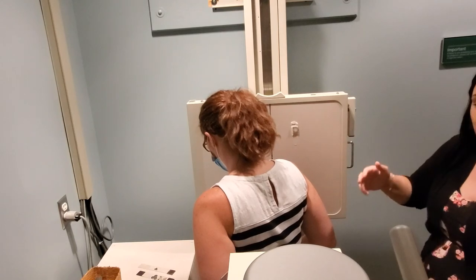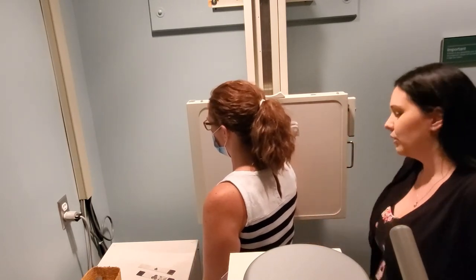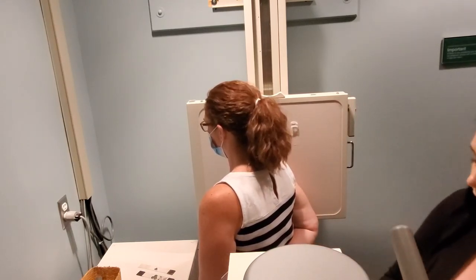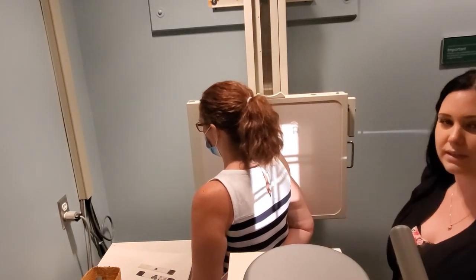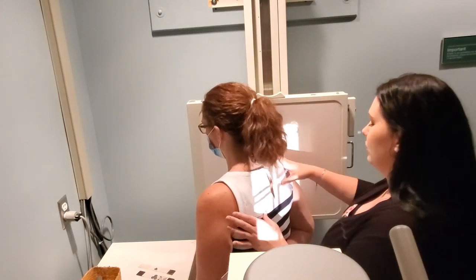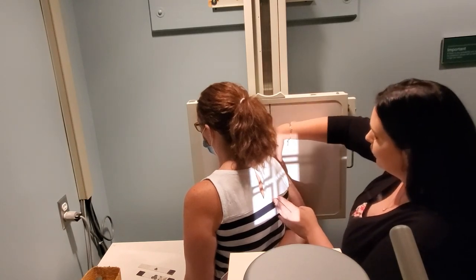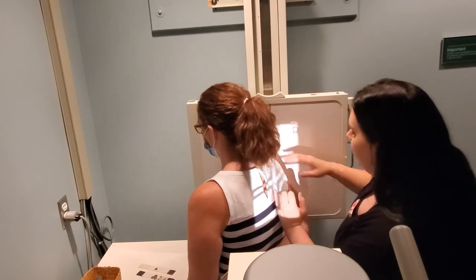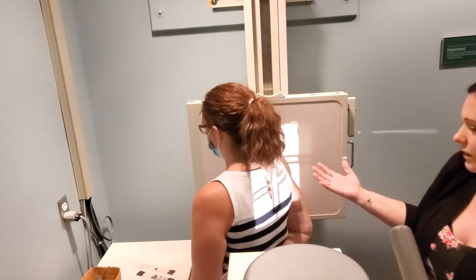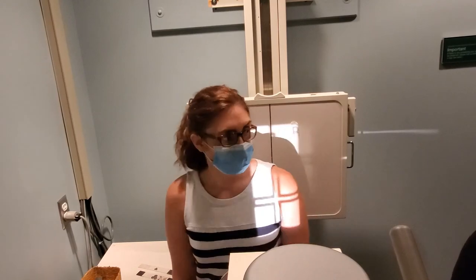The other lateral scapula view is for the acromion and coracoid. It's the same setup as the scap Y, but the affected arm — in this case her right — goes back with the back of the hand resting against the back, bending at 90 degrees. This one is easier because that motion actually pushes the medial border out, similar to rolling the shoulder. Just make sure when they rest the arm down you follow where it goes. Humeral head centered, medial border aligned with the center of the bucky and cassette — that is your lateral scapula for the acromion and coracoid.